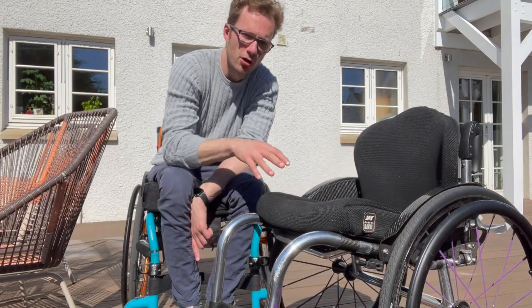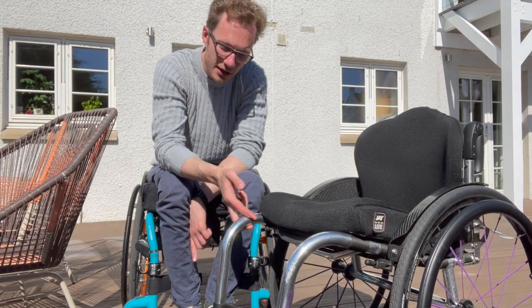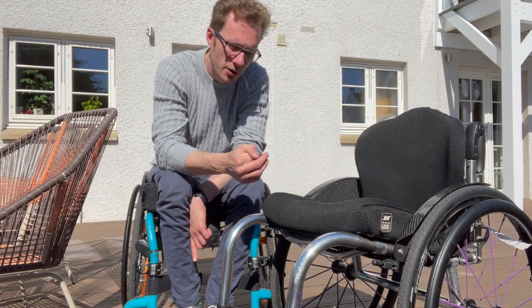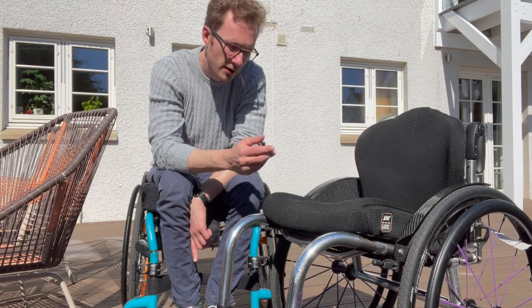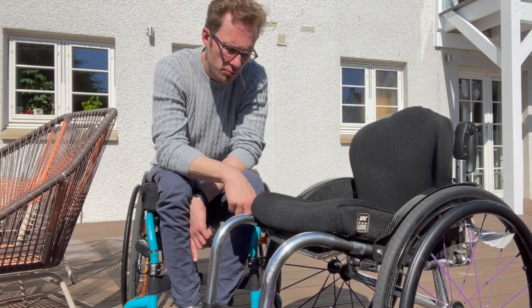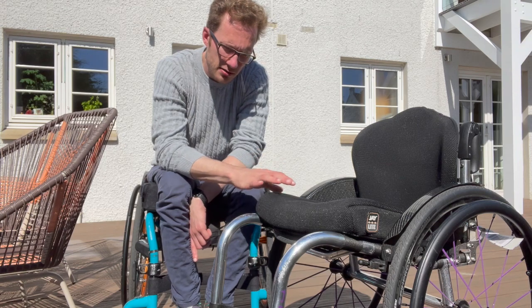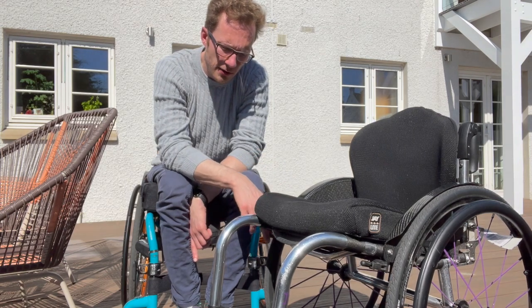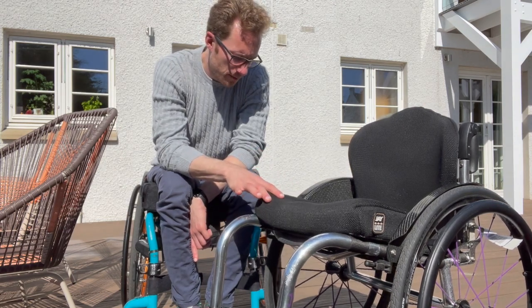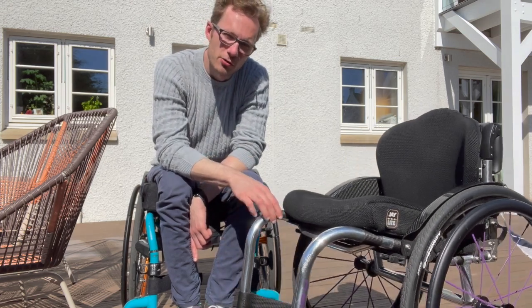Another con is that because it's custom made, if you or your needs change it's difficult to modify something that was made for a previous version of you. One pro I forgot to mention is that there is a warranty — I think it's 12 months for parts and five years for the frame and fixtures. If there's any manufacturing defect they'll repair or replace free of charge, but you can't get anything done through wheelchair services because it's a private chair.